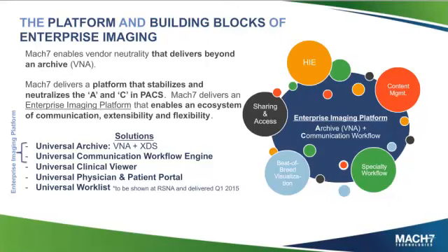So as far as options, I also think that's a good question. If you are implementing this enterprise imaging strategy across your enterprise, and you're consolidating the data across all your specialties, now how do you plug in the viewers? I think there are different levels of viewer integrations that can be done. Many of the, for lack of a better term, more traditional PACS systems can do a DICOM query retrieve kind of interface, and in that case, the pull from those more traditional systems is probably not going to meet your performance requirements for how fast you need images in those viewers.